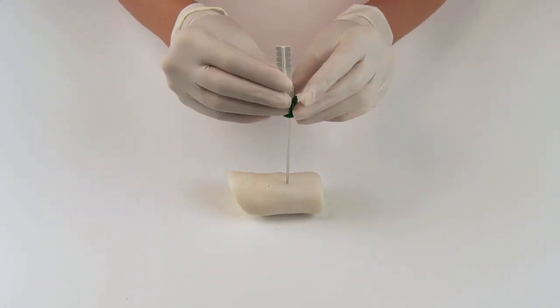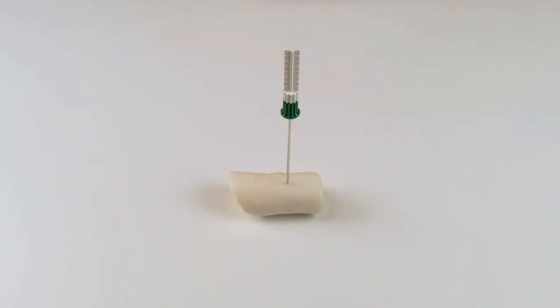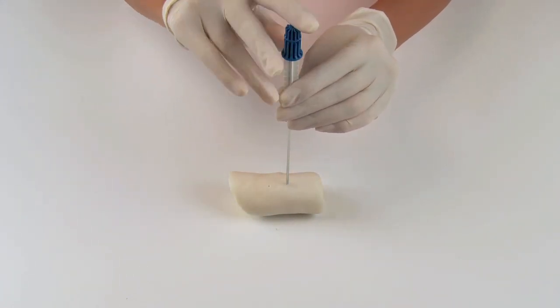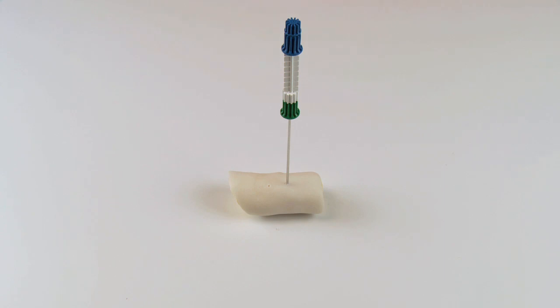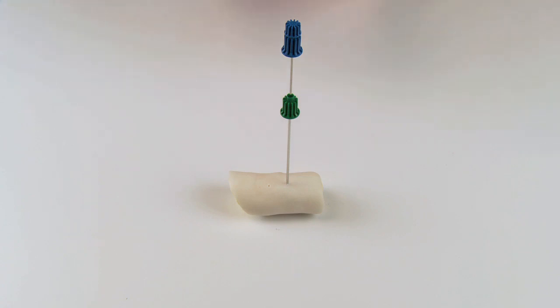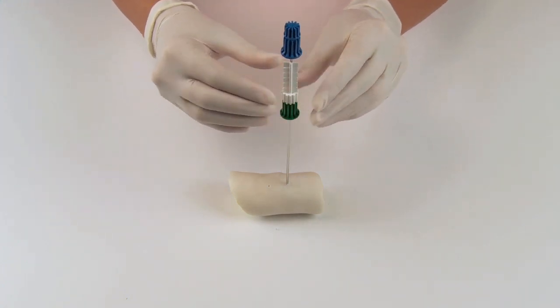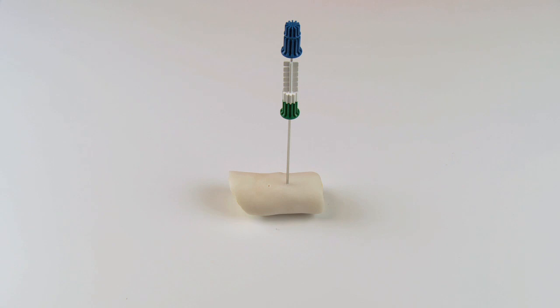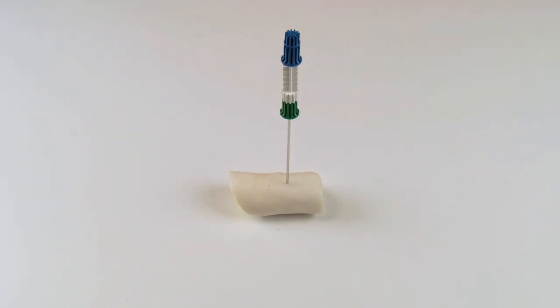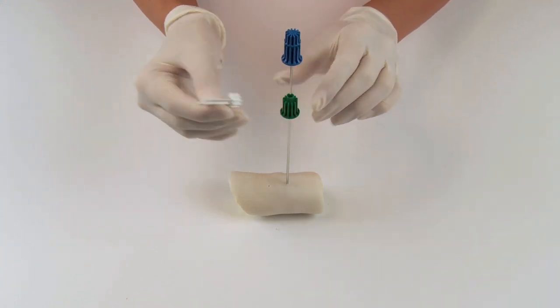Click the depth gauge onto the top of the penetration cannula hub. Insert the biopsy needle. The tip of the biopsy needle will then align with the tip of the penetration cannula. Break off the number of indicators needed to reach the target lesion. Each indicator is 5 millimeters. Now advance the biopsy needle with the stylet inserted to the stop. The tip of the biopsy cannula is now at the targeted lesion. Break off the number of indicators corresponding to the desired length of the sample.